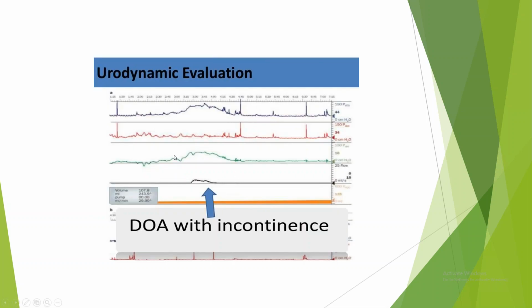Now see, this is a graph. Can you see first is the vesical pressure? Somewhat it is unclear, so I am telling you it is the bladder pressure, first line, blue line. Second line is abdominal pressure. Third green line is detrusor pressure. Then this is the flow. See whether this graph is complete or not. Not complete. Why not complete? The voiding part they have not given.